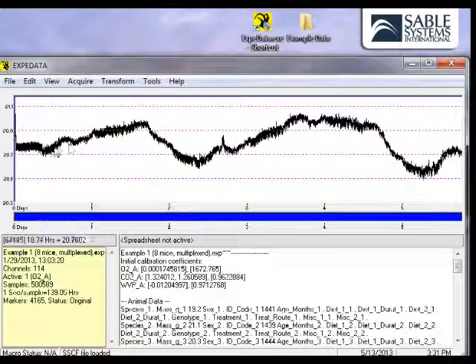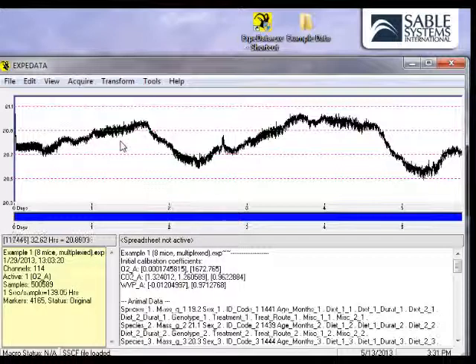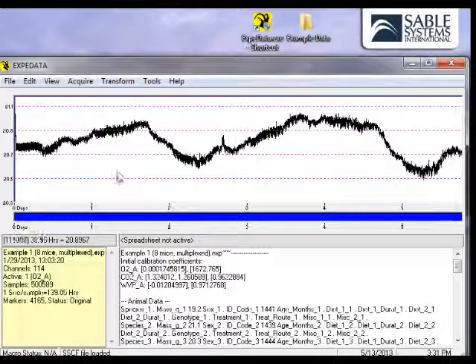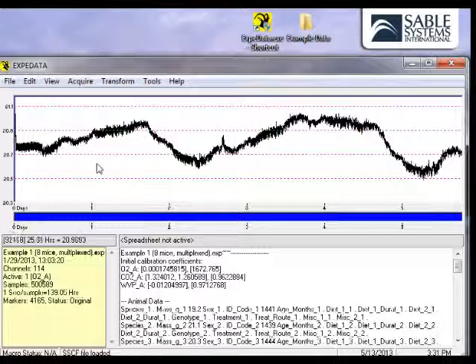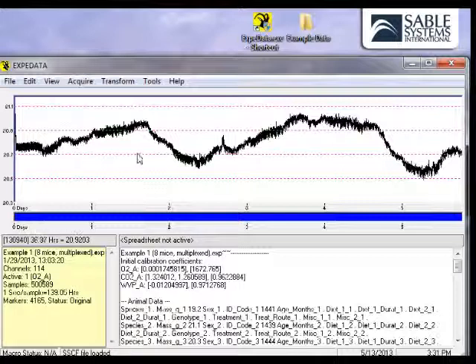Notice that when I move the cursor over the graphics area, you see the sample number at the cursor's position in the little box labeled CursorInfo. You also see the value of the data in the graphed channel, which is also known as the active channel, and the length of time into the recording.